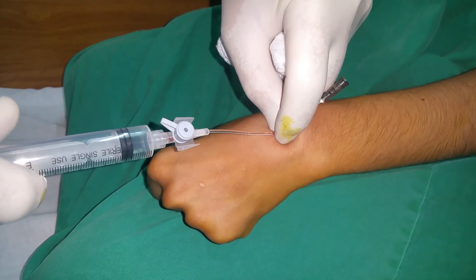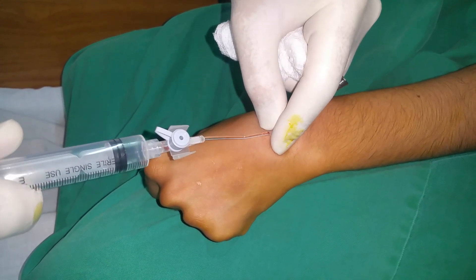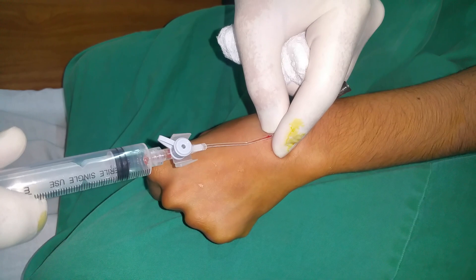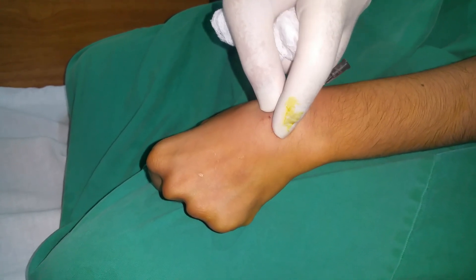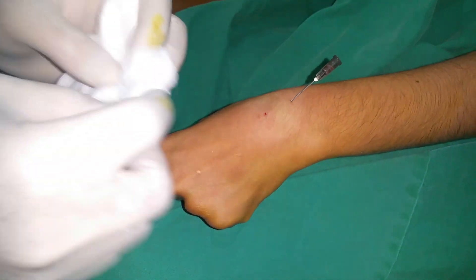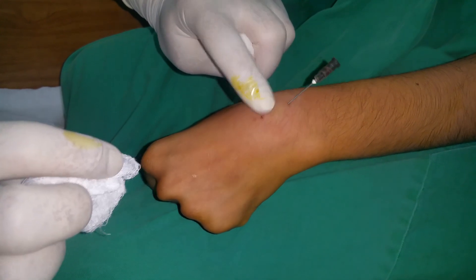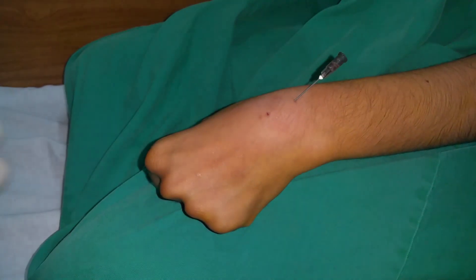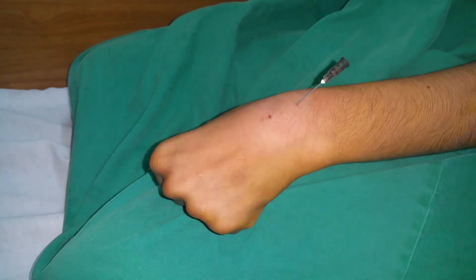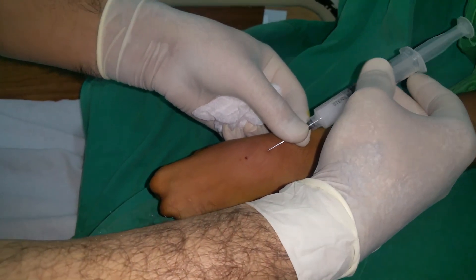We are trying to squeeze the last bit of it. This cavity which was palpable initially is now fully collapsed because of the content we have aspirated. We have already secured that cavity.